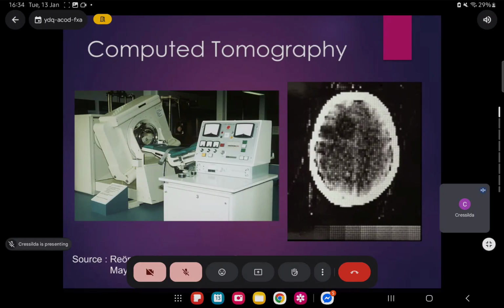Okay, so for CT, this was first performed successfully way back when in the 1970s in the UK at the Central Research Laboratory of EMI. So the very first clinical CT scan of a patient took place in 1971 in London. This patient was a lady with a suspected frontal lobe tumor, scanned with a prototype scanner developed by Godfrey Hounsfield and his people in the EMI. And then they were able to take this particular image.